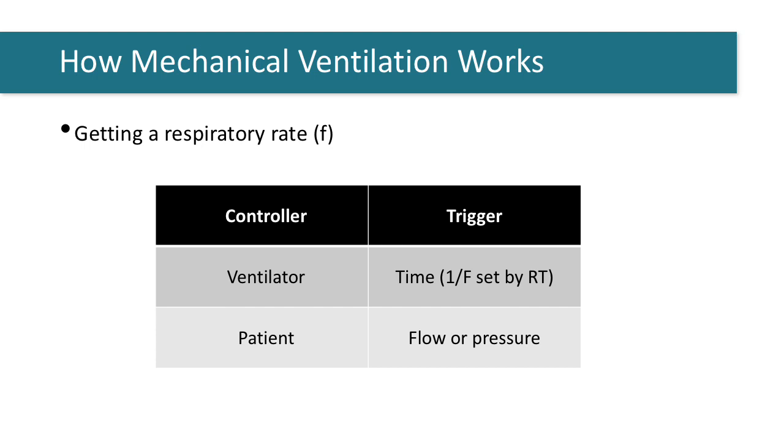The ventilator can also be triggered by the patient because of fluctuations of flow or pressure within the ventilator circuit that the ventilator senses as patient inspiratory efforts. Certain modes of mechanical ventilation will sense the patient based on diaphragm electrical activity, but the basic modes of ventilation rely on flow or pressure. In some, the triggering mechanism determines how often a breath is delivered, or the respiratory rate.